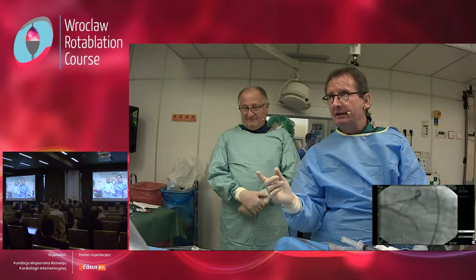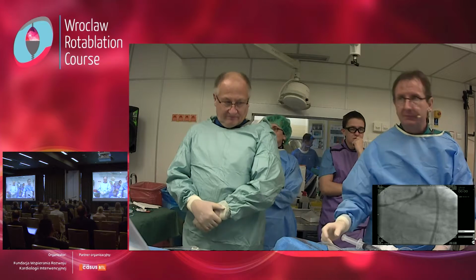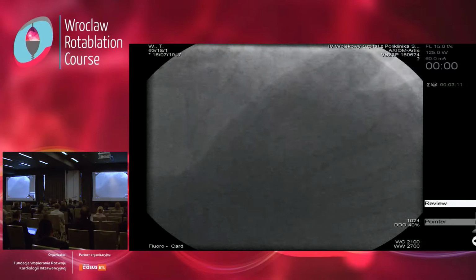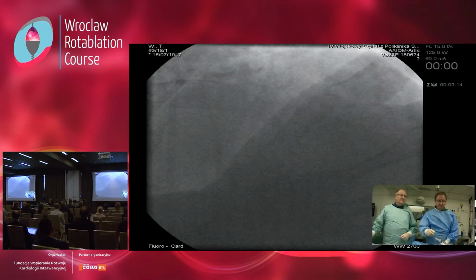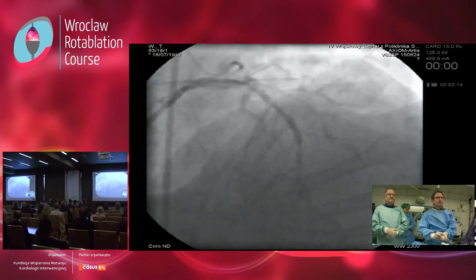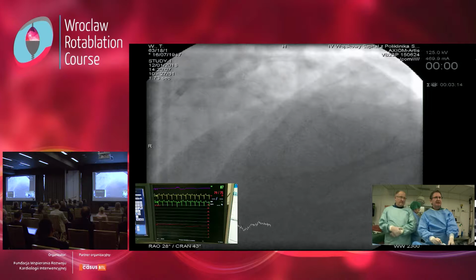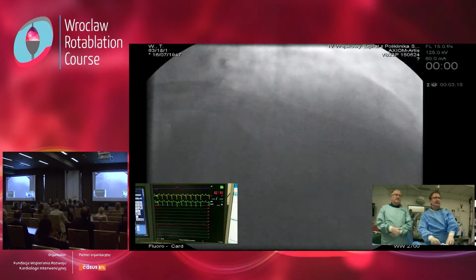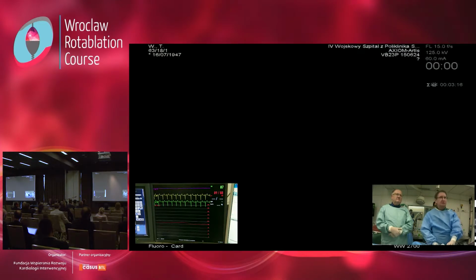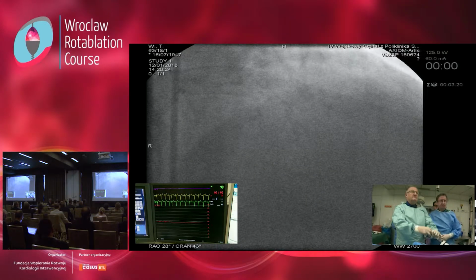I don't know, did you see the case presentation? Yes, we did. Okay, so can you see now the angio? Now we see angio. You see the patient's hand, so one more shot to understand better the anatomy. So Maciek is doing this.